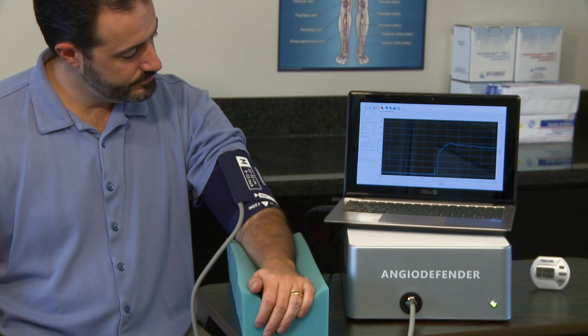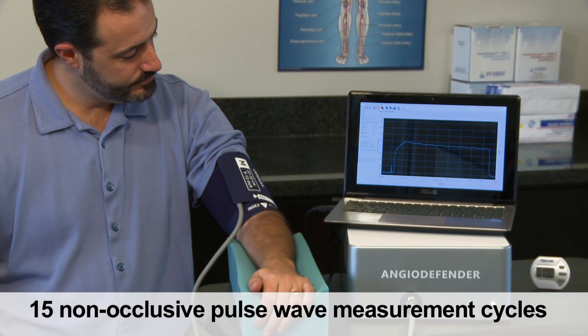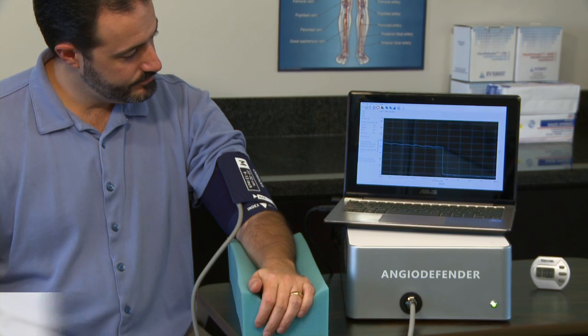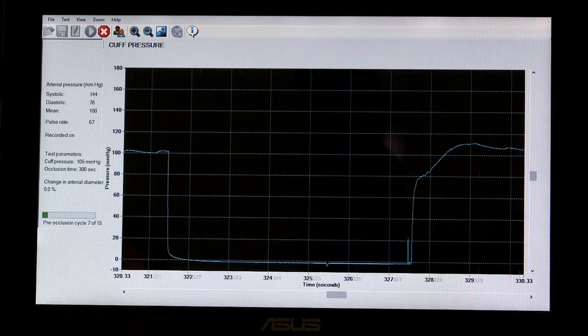After the 3 minute rest period, there is a sequence of 15 non-occlusive pulse wave measurement cycles, each consisting of 9 seconds with the cuff inflated to approximately mean arterial pressure, followed by 6 seconds with the cuff deflated.